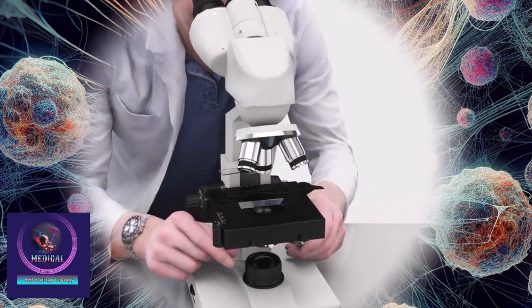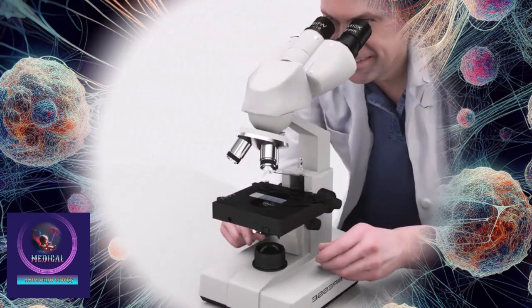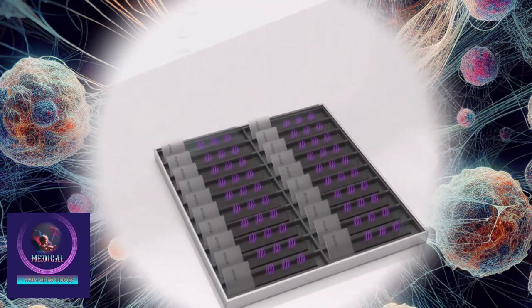The process begins with patient preparation, where the area of interest is identified using imaging techniques like ultrasound, CT, or MRI.